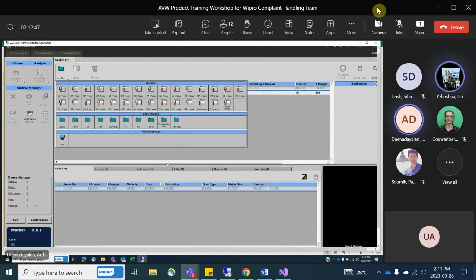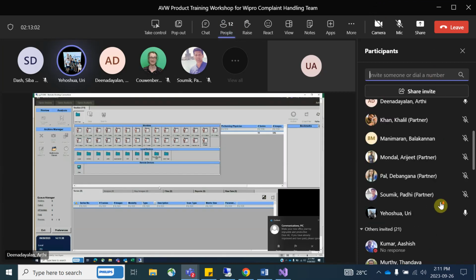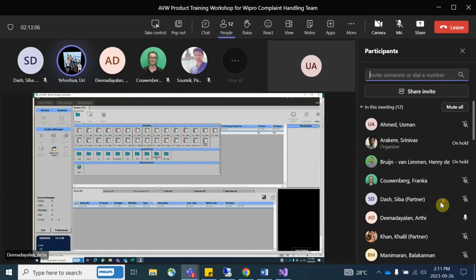No, who can create a user? In order to create a user, you need the IP address and the admin password and account, which is general. Is it correct?